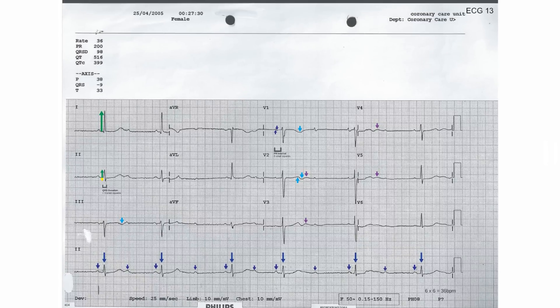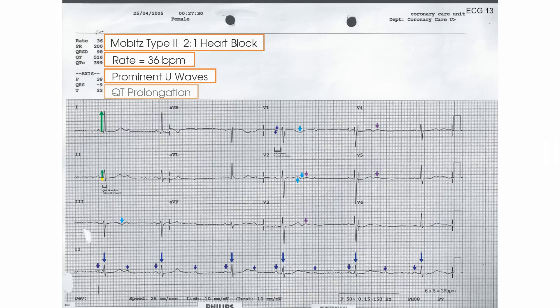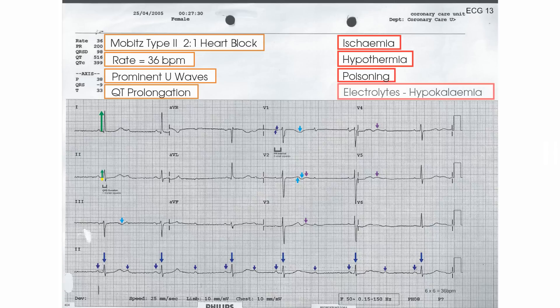In summary, the ECG shows 2 to 1 heart block with a conducted rate of 36 beats per minute, with prominent U waves and QT prolongation. The differential diagnosis is broad, including ischemia causing conduction delay, hypothermia, poisoning, and electrolyte abnormalities — most typically hypokalemia.